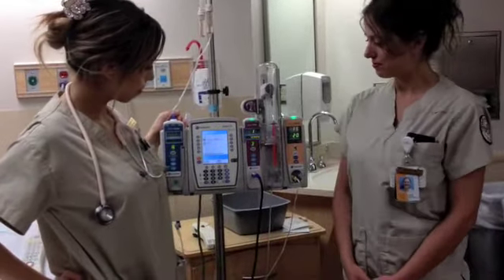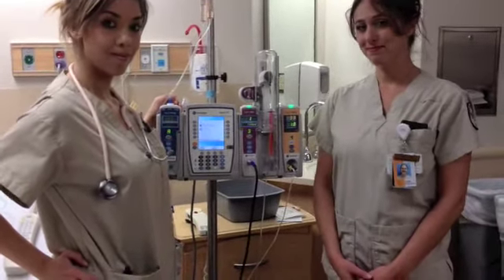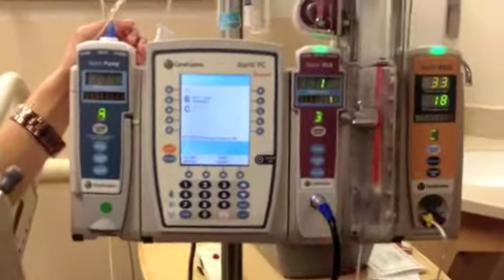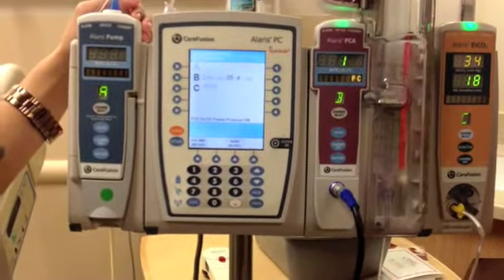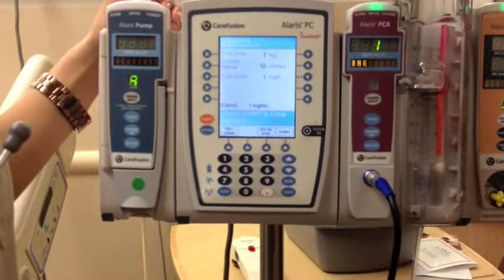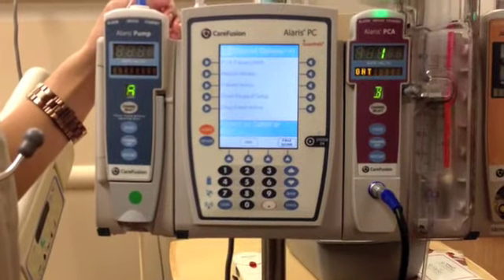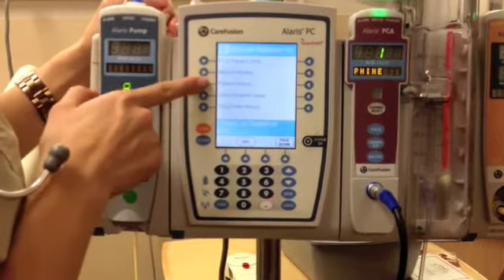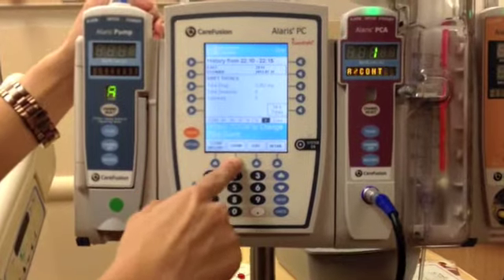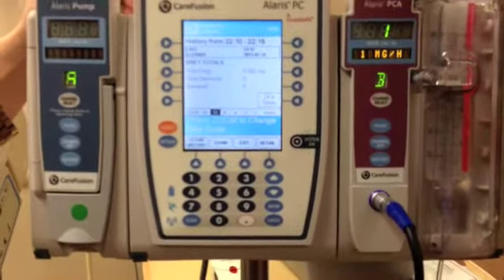When the nurse wants to review the history at the end of the shift, make sure to verify with the secondary nurse. To review the 24-hour end-of-shift report, channel select on your PCA pump. You will now go to the options and the main infusion pump. Go to Patient History. Press the zoom button until it goes to the 12-hour shift mark. Review the totals with a secondary nurse and confirm what you see.